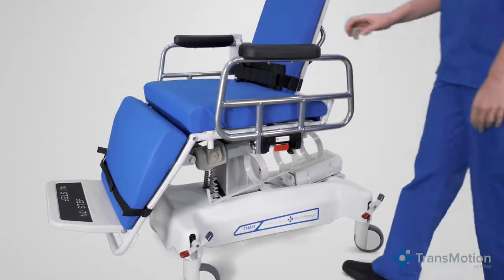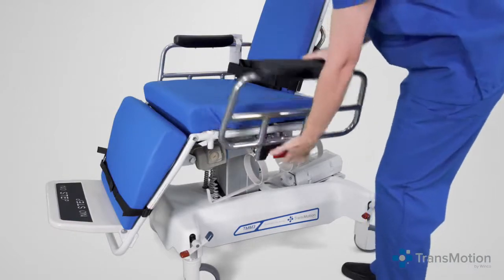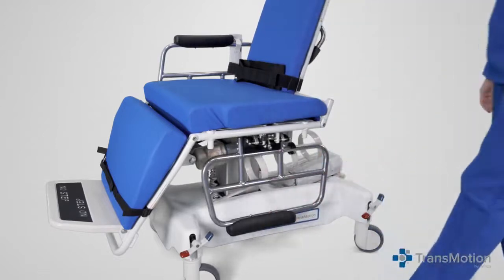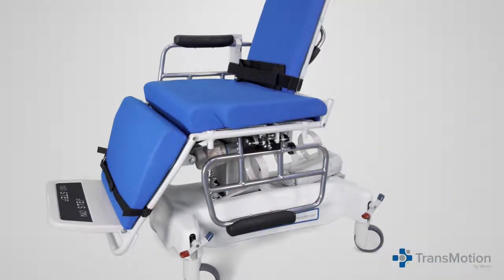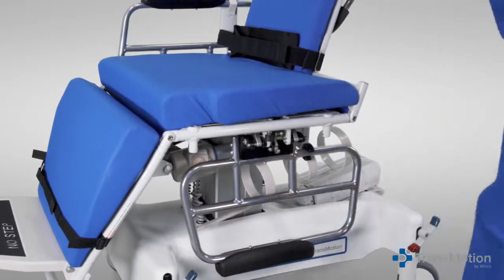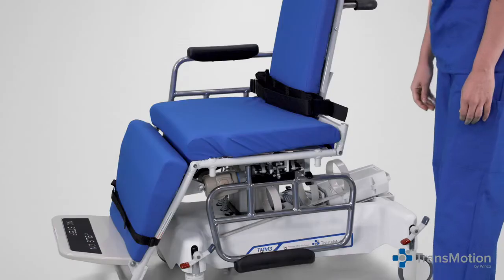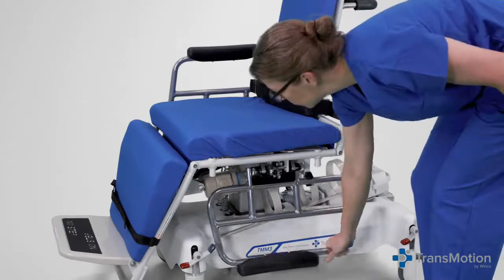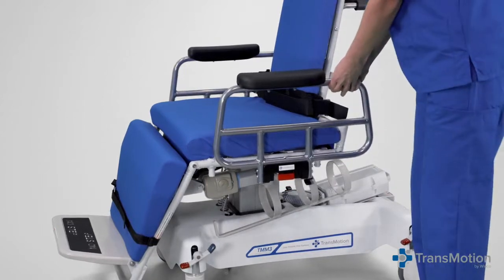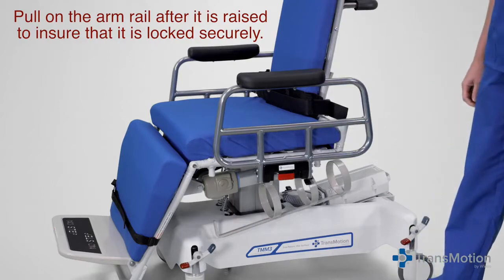To lower the arm rail, grasp the top of the arm rail and push in slightly while pulling out on the rail release tab. Once the arm rail latch is deactivated, the arm rail can be lowered into the down position under the seat. Once under the seat, push in on the arm rail to engage the arm rail retainer. To raise the arm rail, simply lift up on the arm rail until it's in the up position. The arm rail latch will engage automatically. Remember to pull on the arm rail after it's raised to ensure that it's locked securely.